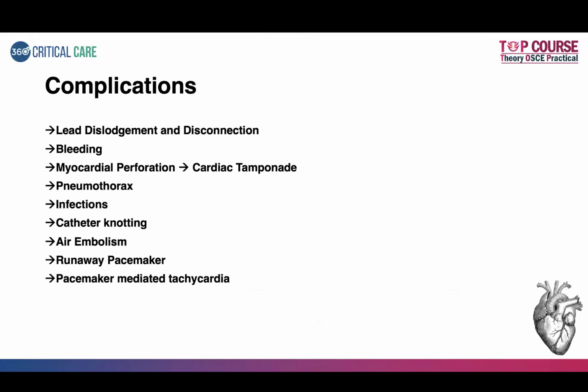So the complications are almost similar to those of temporary pacing. So you have lead dislodgement and disconnection, bleeding, myocardial perforation that can lead to cardiac tamponade, pneumothorax, infections, catheter knotting, air embolism, runaway pacemaker, and pacemaker mediated tachycardias.